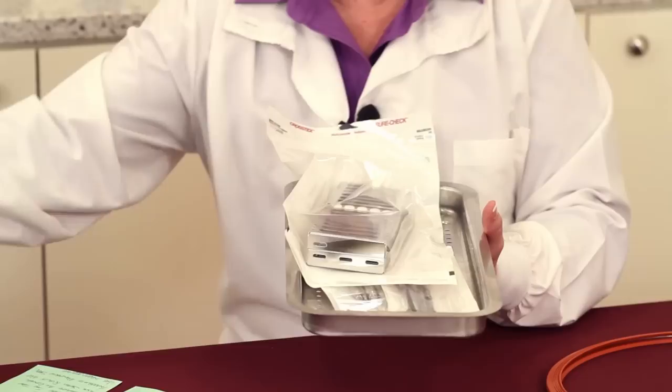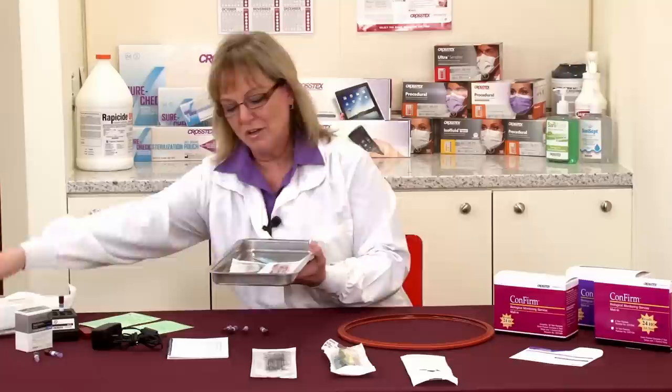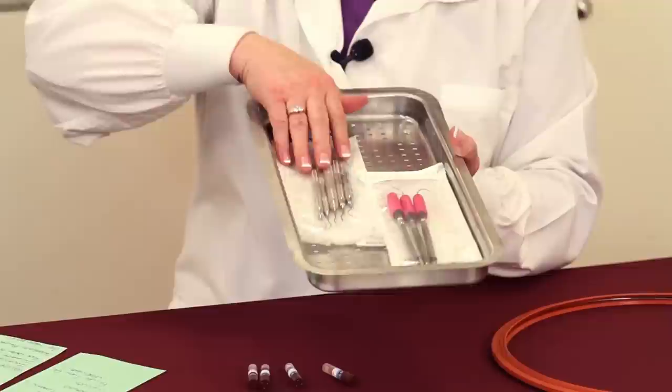The first thing that we have to think about, believe it or not, is related to human error. Because the number one cause of failure of biological monitoring is overloading of the sterilizer. You want to make sure that you don't have it overloaded, because if you have to get through all these layers to get to the spore test, that's going to be one reason that it fails.